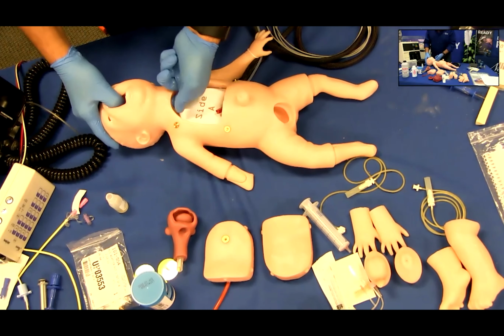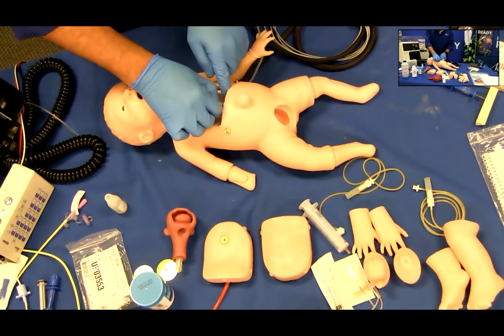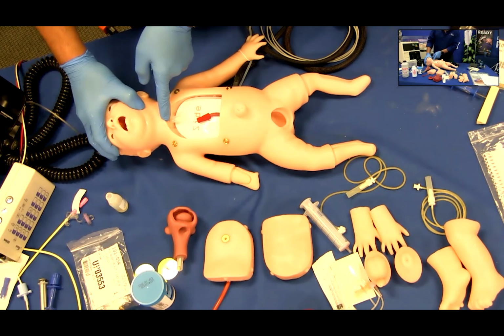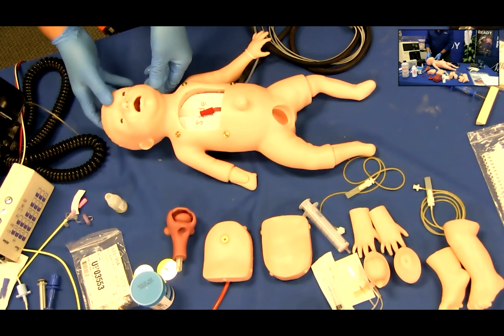Gently pull up the defibrillation chest insert. Please use caution to not detach the electronics, and slide the tube from the airway into the hole at the top of the chest insert. Fit the chest insert back into the chest cavity.